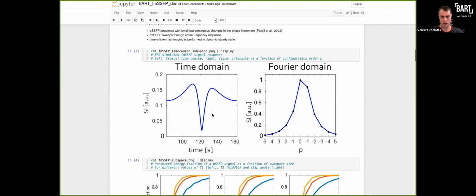In a gradient echo sequence, of course, you also might have a steep decay or so, but off resonance shows up differently in your signal. So you don't get this kind of closed loop, right? Yeah. So the Fourier subspace would probably not be appropriate for anything that is related to standard gradient echo sequences, I guess.